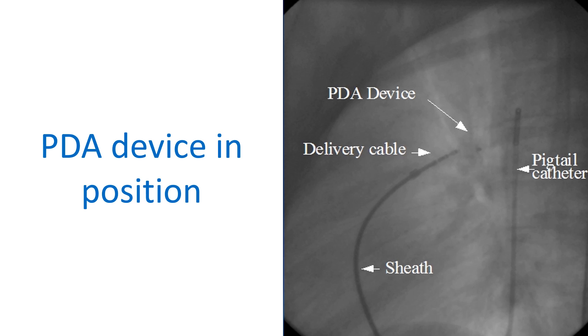The delivery cable is still attached to the device. The long venous sheath and pigtail catheter in the descending aorta are also seen.